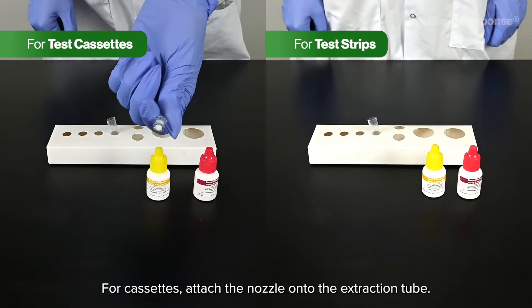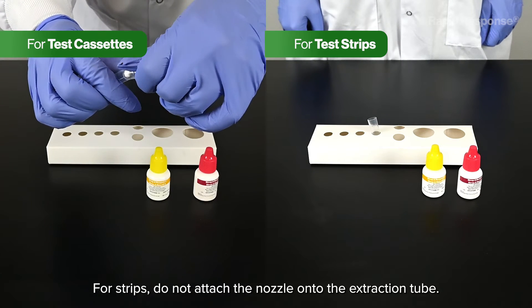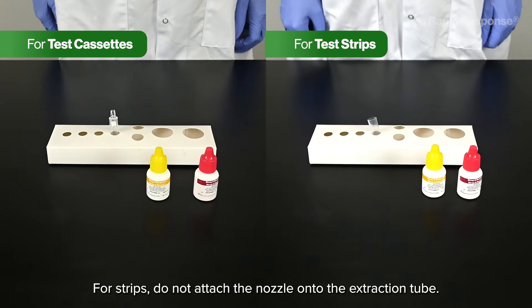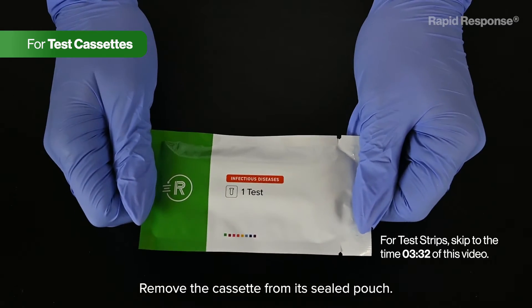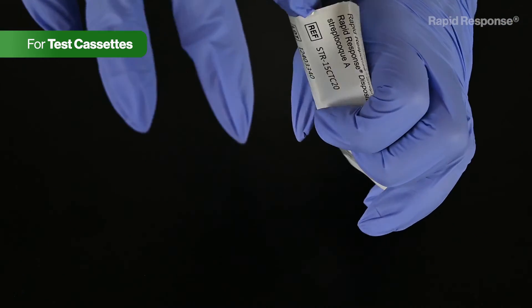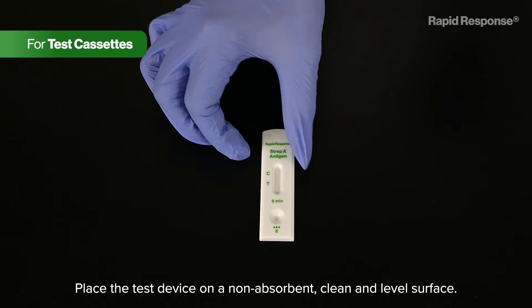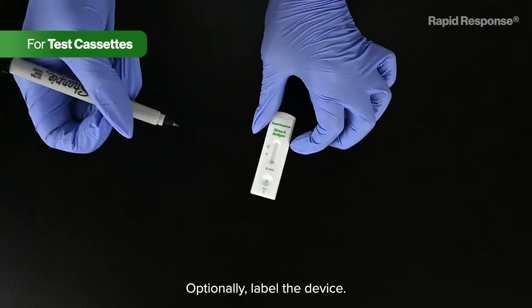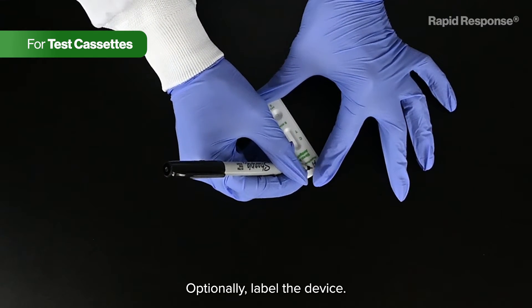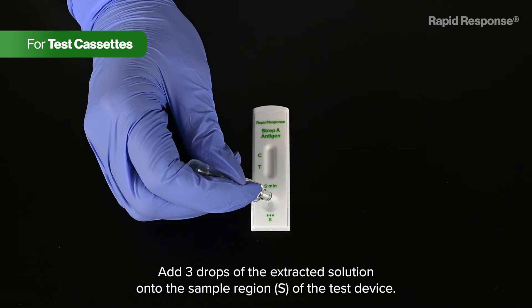For cassettes, attach the nozzle onto the extraction tube. For strips, do not attach the nozzle onto the extraction tube. Remove the cassette from its sealed pouch. Place the test device on a non-absorbent, clean and level surface. Optionally, label the device.